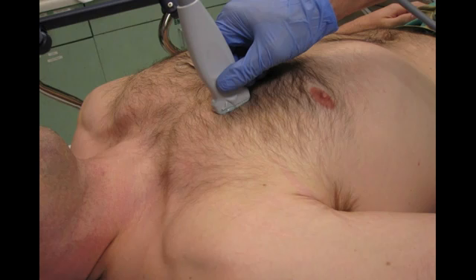But at any rate, what you use is a linear probe that you orient longitudinally, so in the long plane of the body, looking in about 3 interspaces on each side. So we're trying to get in between ribs to look down into the pleura and see the pleura sliding. And that pleural sliding is really the critical thing to identify when we're doing this exam.